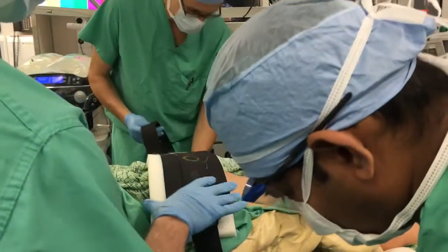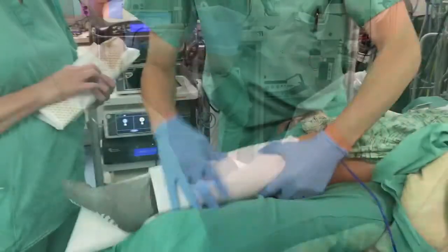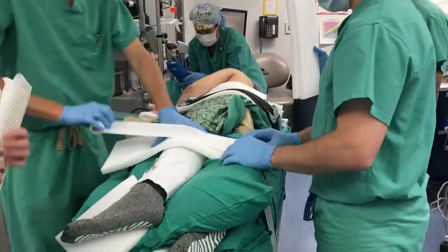A seat belt is then applied across the lateral pelvis. We then place a pillow between the lower extremities to pad the bony prominences and tape a piece of foam padding over the top of the lower limb ipsilateral to the operative side.